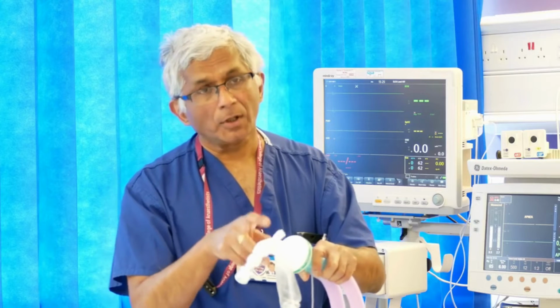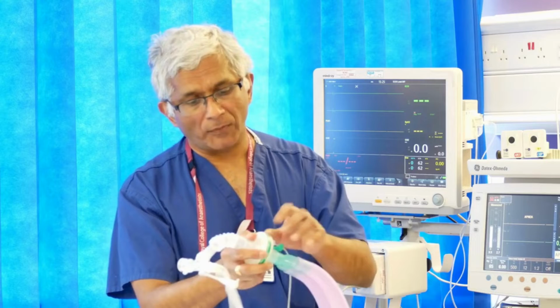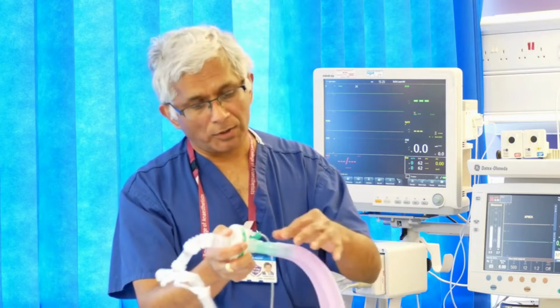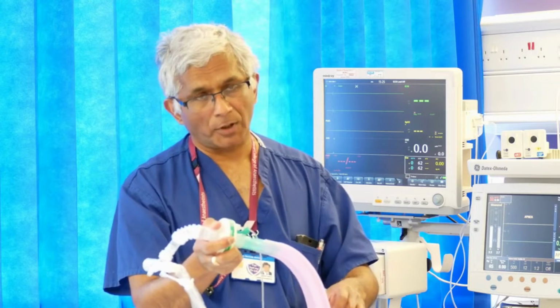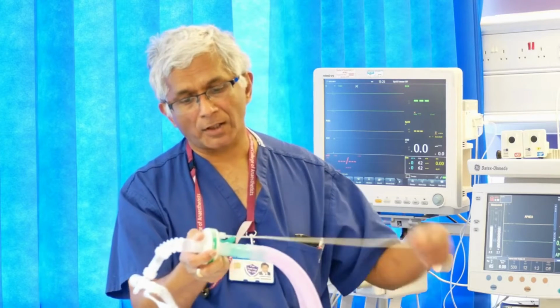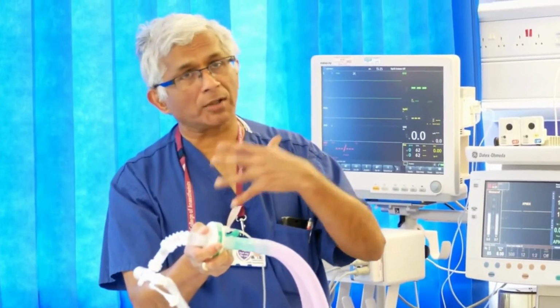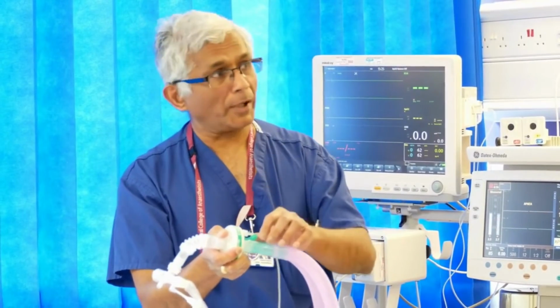There's a filter here, and the filter is connected to the breathing circuit with an inspiratory and expiratory limb, and there's another connection here to measure the carbon dioxide coming out from your breath.